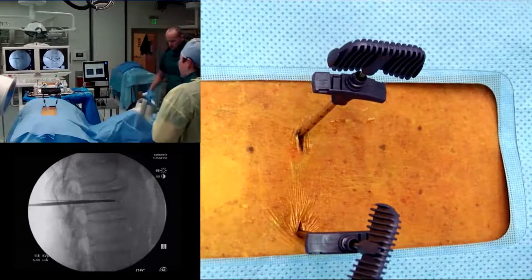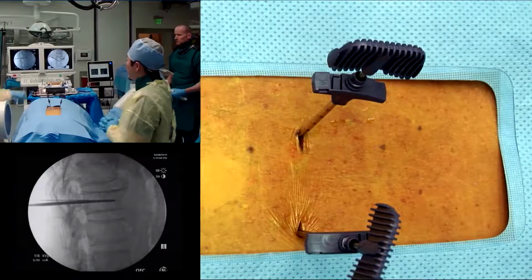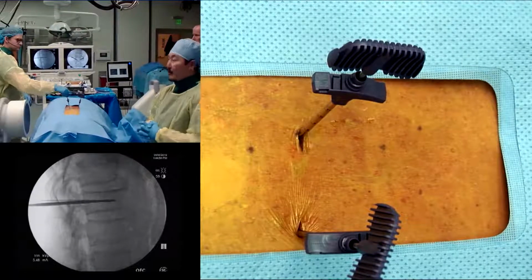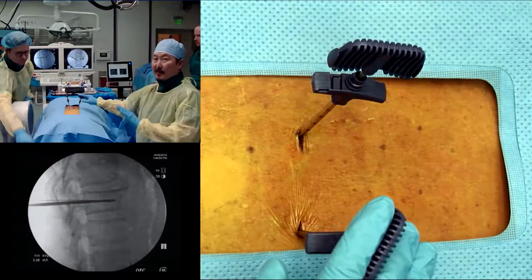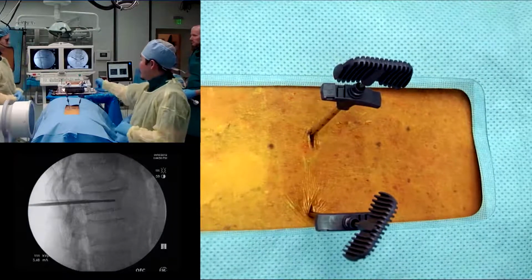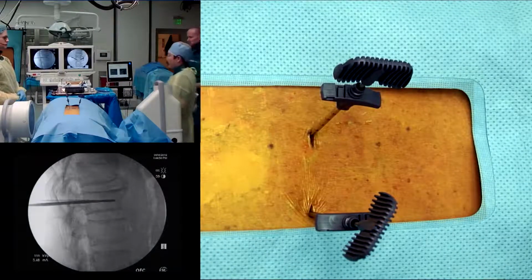There's sort of a new technique that we're going to show you here, and this is relatively new actually. So instead of going straight to the inflatable balloon tamp, we're actually going to show you a demonstration over here of a new radiofrequency probe.